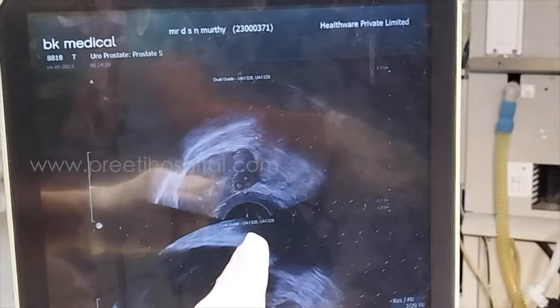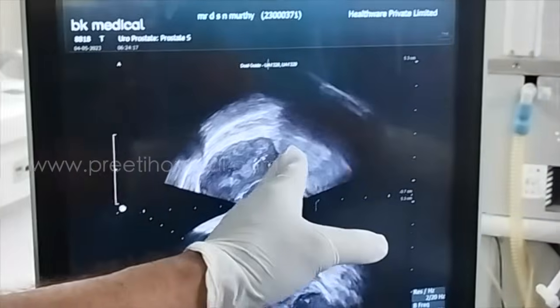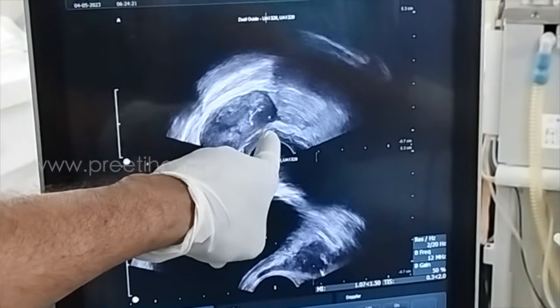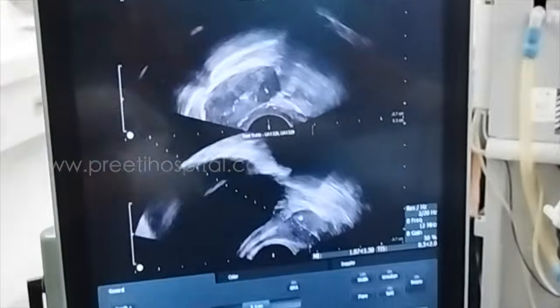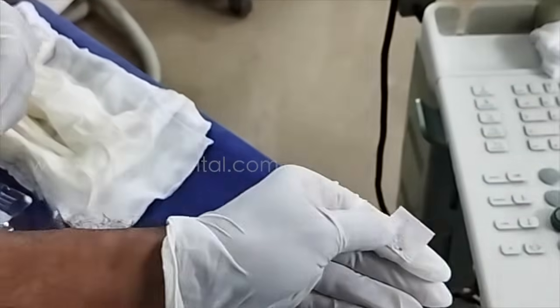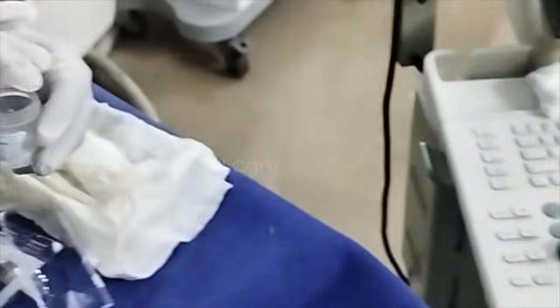You can see. Go extreme lateral of the mid-zone, left side, extreme lateral left side. This is extreme lateral here. Yeah, now it is fired. This is a total of 8 pieces. This piece also came nicely, a vertical piece.